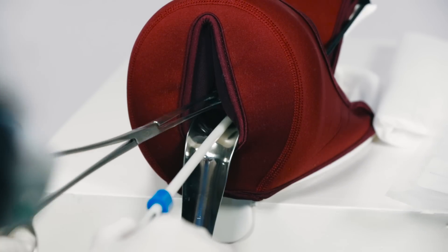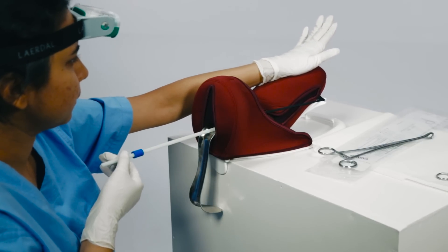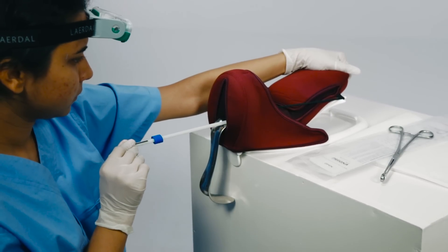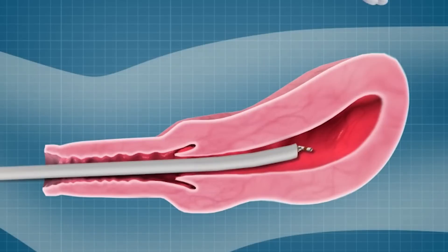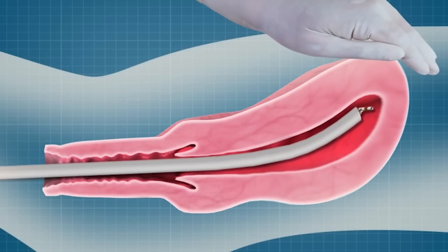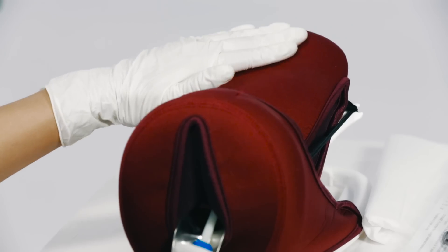Remove the ring forceps. Move your hand to the fundus and gently depress or stabilize the uterus. Gently move the PP-IUD inserter upwards towards the fundus following the curve of the uterine cavity. Confirm that the IUD has reached the fundus.